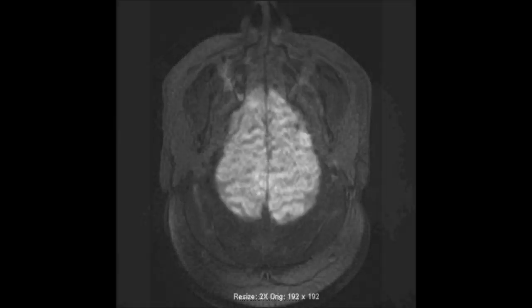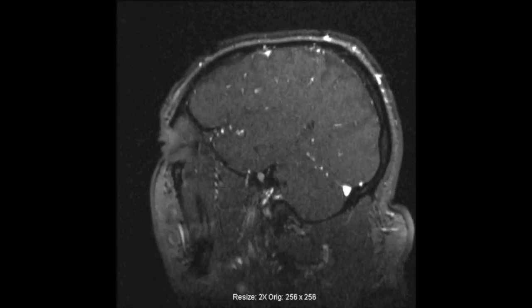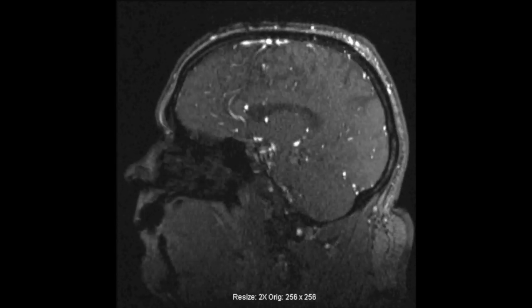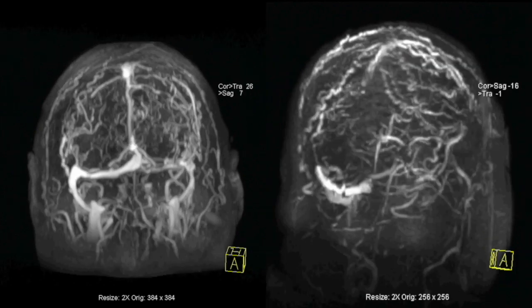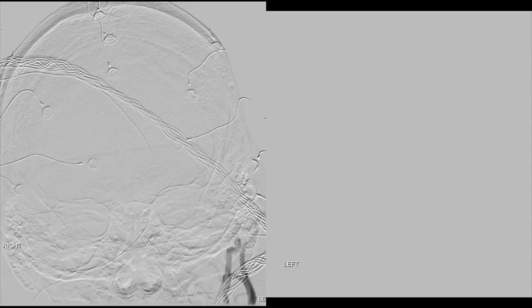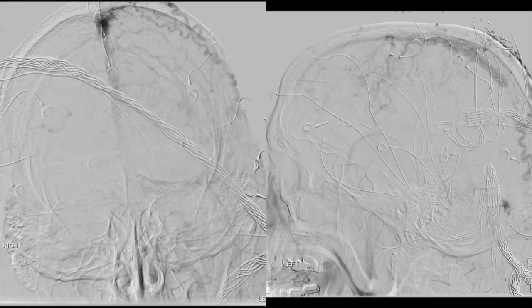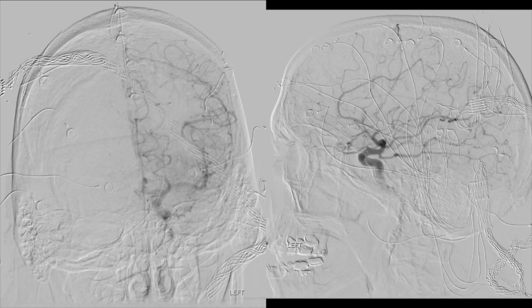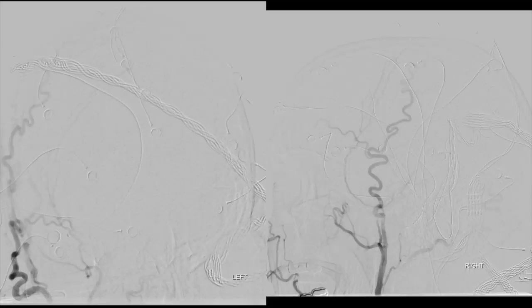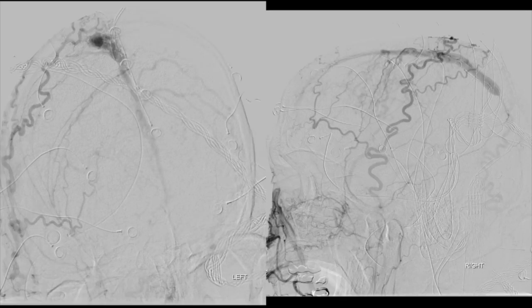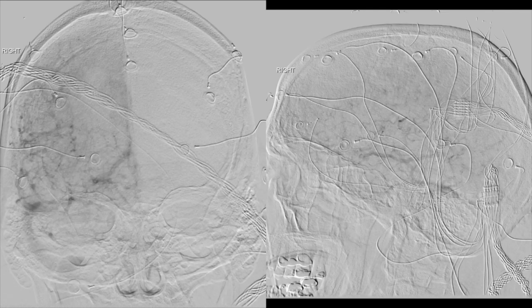MRA and MRV images were remarkable for a paucity of filling of the posterior third of the superior sagittal sinus. The cortical veins appeared prominent and larger than expected on both sides. Catheter angiography demonstrated on selective left external carotid injections a opacification of the anterior third of the superior sagittal sinus with anterior drainage. Selective internal carotid artery injections demonstrated no arterial abnormality but a noticeable lack of superior sagittal sinus opacification on the late venous phases.